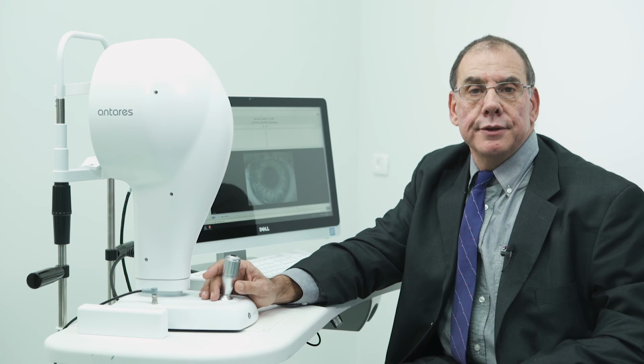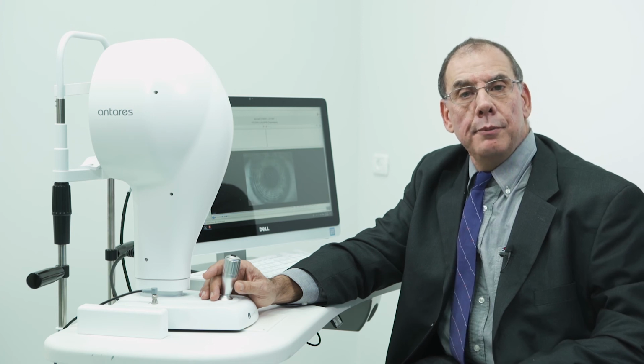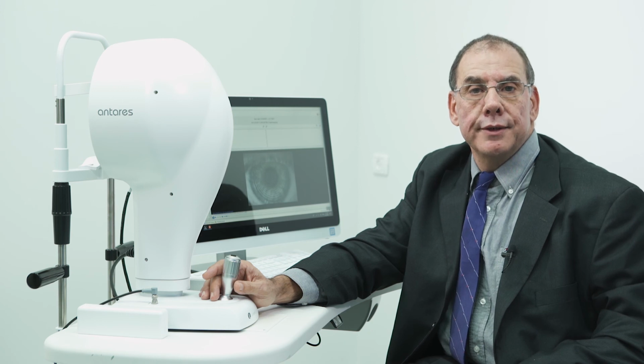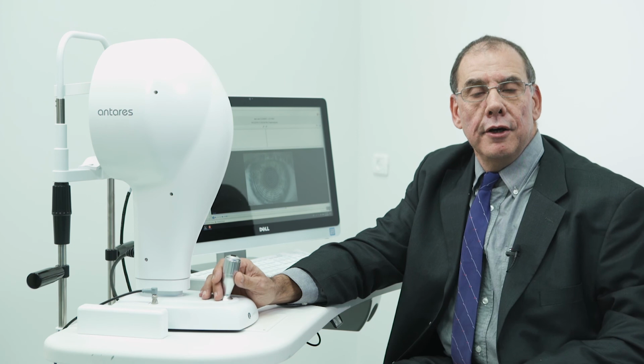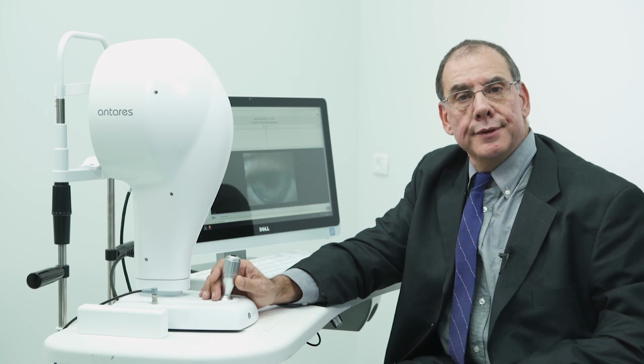Most patients that have got a breakup time problem will break up maybe after 1, 2, or 3 seconds. Therefore, the 10 seconds is more than enough to give us an idea of when the first breakup took place.